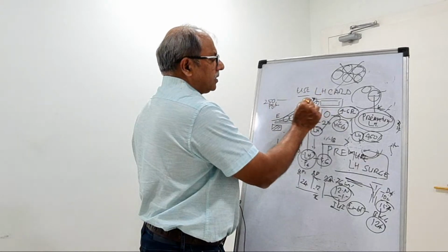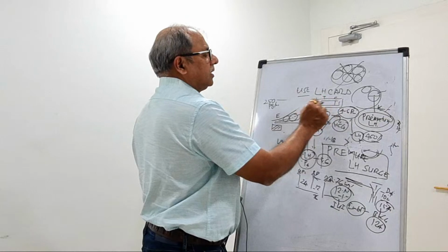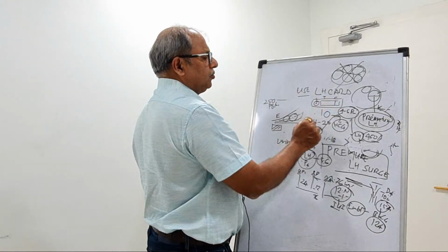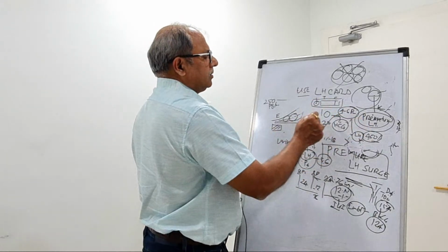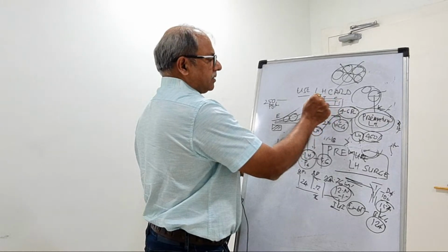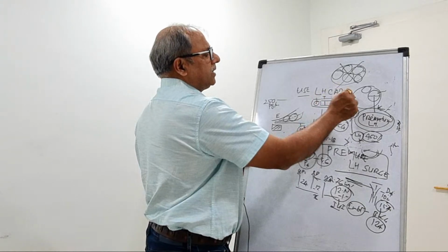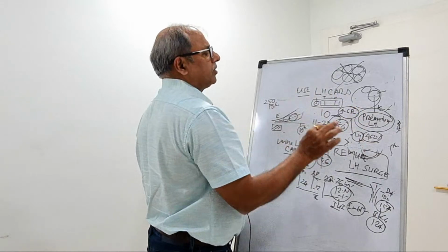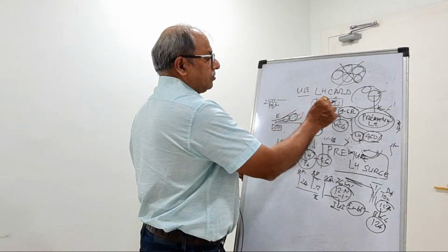Put this urine here, and there is a test line and there is a control line. If only the control line is there, no test line, it is negative. So you can continue with the stimulation or with the ultrasound. If one day it comes with a test line also, it is the day of LH surge. Next day, you can do IUI. You can do IUI this way if you are not using HCG.